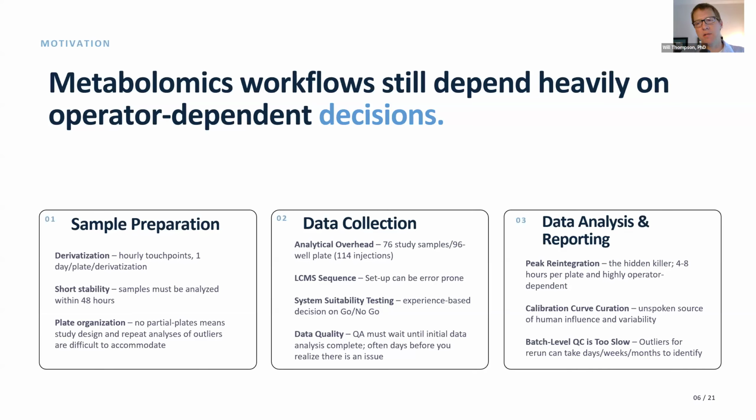And then finally, I mentioned before this very large one with peak reintegration. It's a hidden killer, 4 to 8 hours per plate was our running number, depending on the number of specimens and the number of analytes. Highly operator dependent. And then calibration curve curation is another one, where what fit you use and which points you exclude is a hidden, unspoken source of potential human variability in the results.